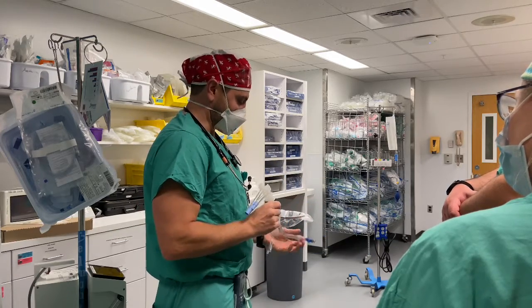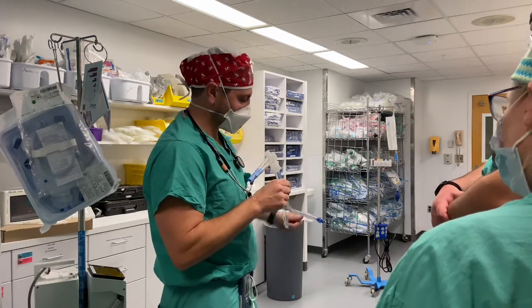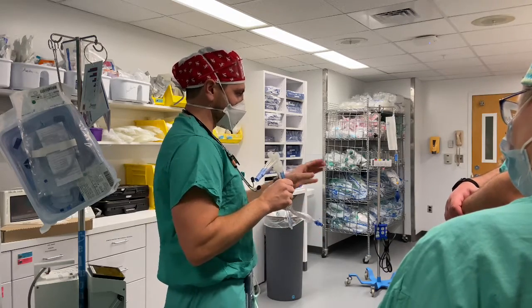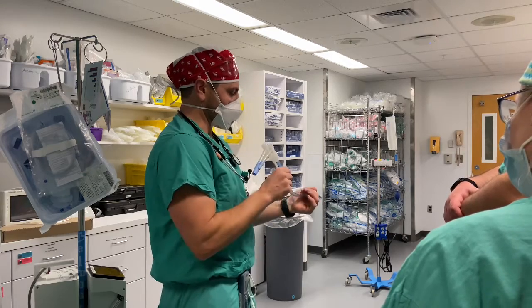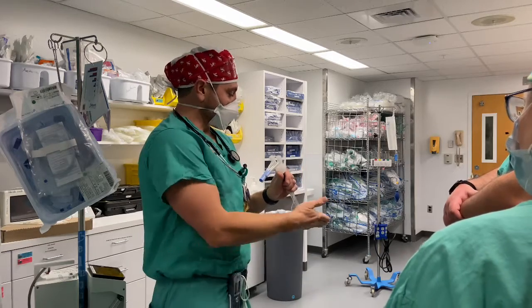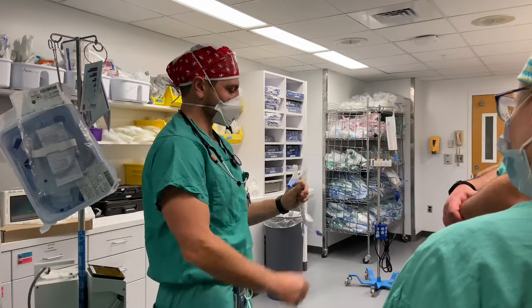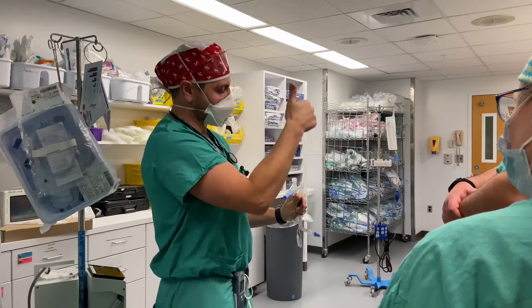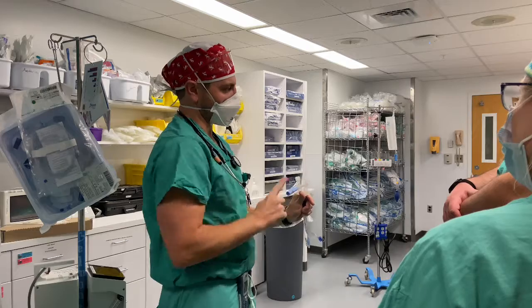First thing we're going to do is inflate the tracheal cuff, so we actually have the ability to drive positive pressure into the airway. Second thing we're going to do is inflate the bronchial cuff, so that we've now isolated right from left, okay? This just occludes the trachea so that we can blow air in. This balloon separates right from left. So if we're going to work on the right side, we don't want that side moving, right? So we do two things. We pop this open on the right side, the bronchial side, so that air can escape. And then we put a clamp right here so that we no longer are driving air in.